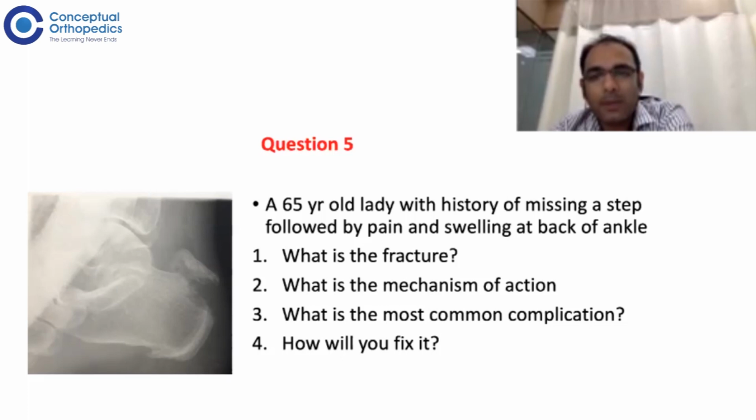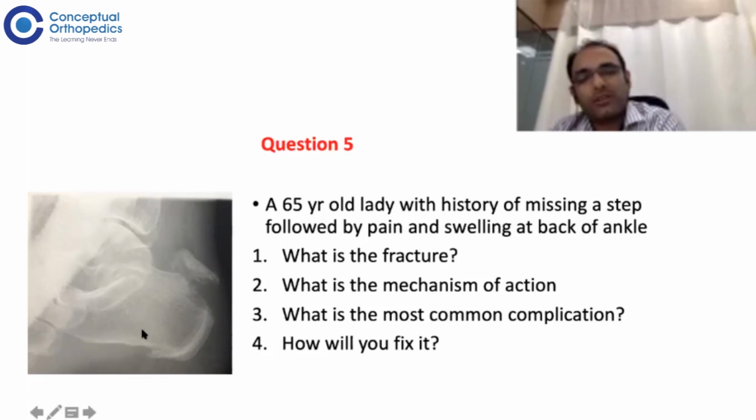So complications, whether managed surgically or without surgery, include skin-related issues. Infection would be one of the most common complications. And now, how will you fix it? In this case, the most common modality of fixing these fractures has been putting a screw through the fracture site and going into the calcaneum.